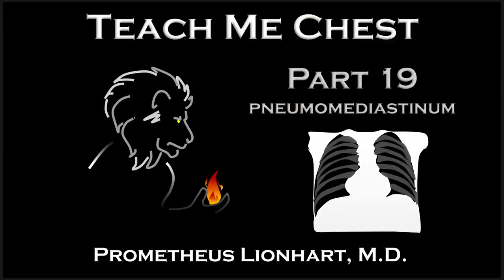Alright, welcome to the 19th lecture in our series on the chest radiograph. This lecture will continue with a discussion of the region of the heart, this time with a specific attention to the presence of abnormal air in the mediastinum.